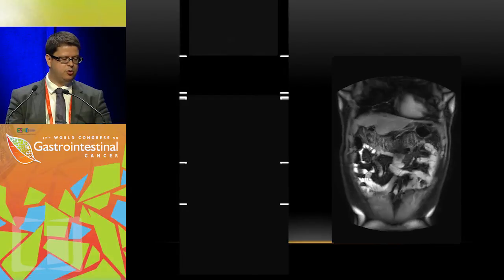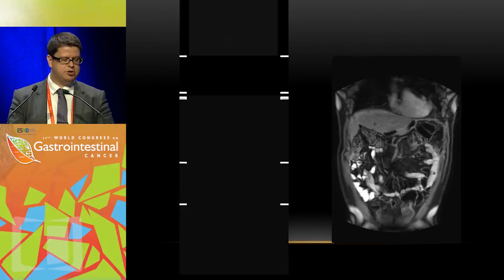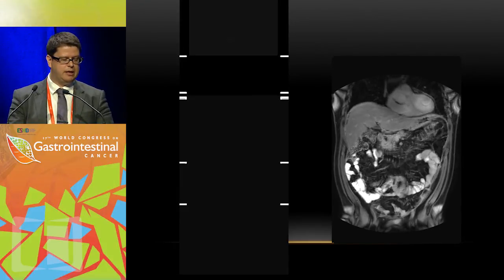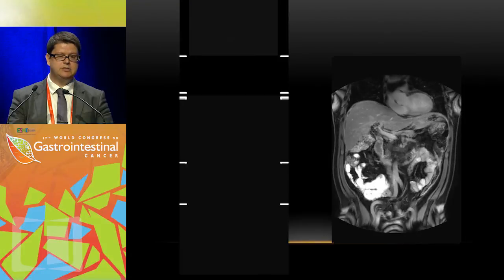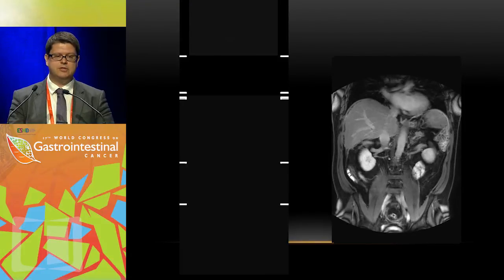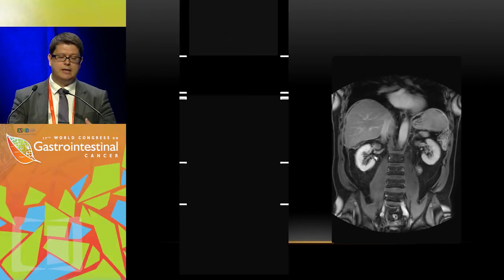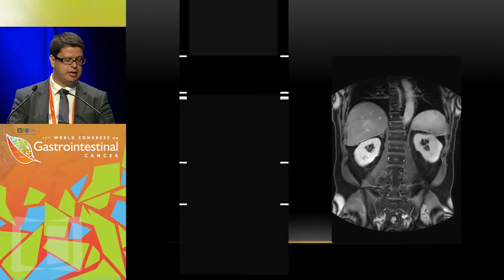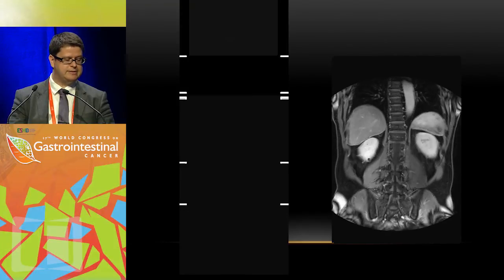The lesion conspicuity. So this is why we have just left contrast-enhanced MRI, because you can nearly not obtain the image. Here you can see the disease around the diaphragm, but it's very difficult to see the disease on the bowel. And this is the big advantage that the diffusion MRI has brought us in addition to contrast-enhanced MRI.